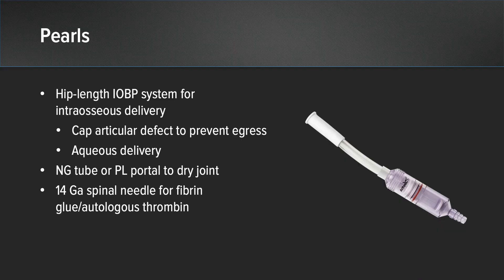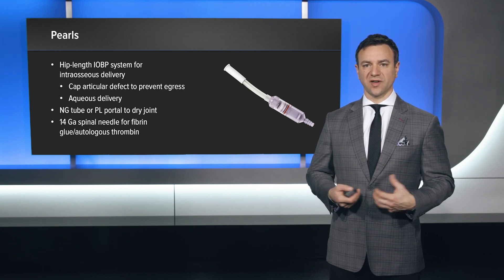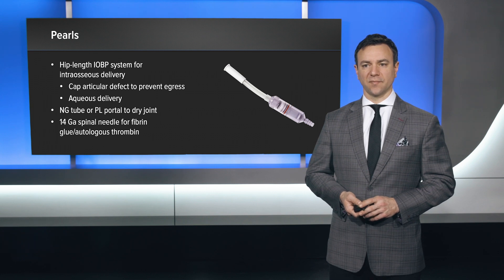A hip-length IOBP needle was used in this case because of the increased depth in the body habitus dimensions of the patient. This allowed for effective intraosseous delivery of our bioactive substrate. We capped the articular cartilage to prevent egress. We did use an aqueous delivery into the cyst, while the biocartilage was delivered in a dry environment. Our preference is to use either an NG tube to evacuate residual fluid from the joint, or to create a posterolateral portal with suction-based pledgets or simple suction equipment through the posterolateral portal. A 14-gauge spinal needle was introduced through a distal accessory portal using fibrin glue or autologous thrombin to mature the graft construct in this particular case.